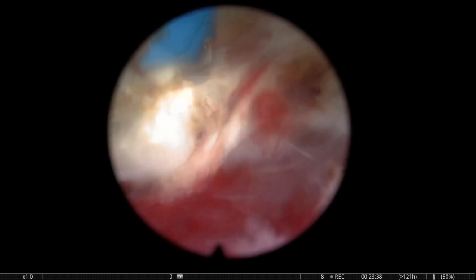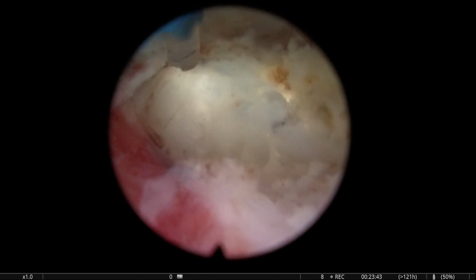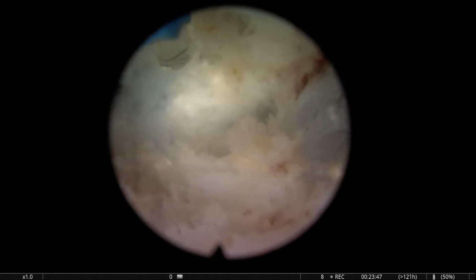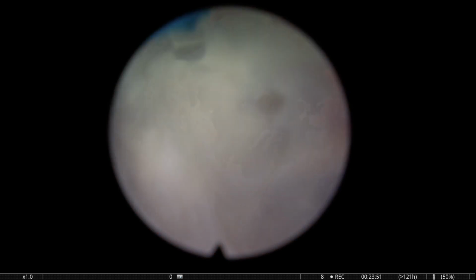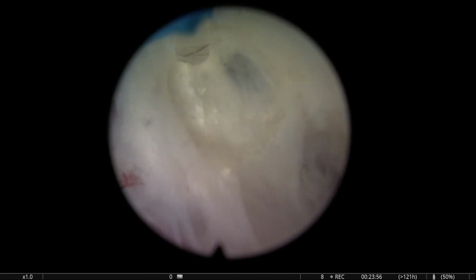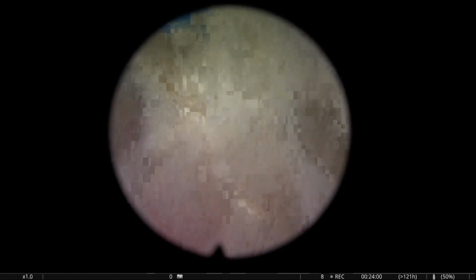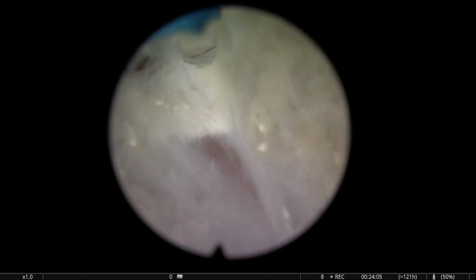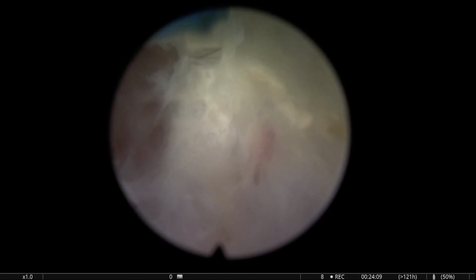So if you identify the line, with two planes, the capsular plane and the adenomatous plane, it's like the line formed by the pages of an open book. What I'm saying is, instead of firing against the line, you fire on the upper page side. That will keep the energy close to the adenoma.